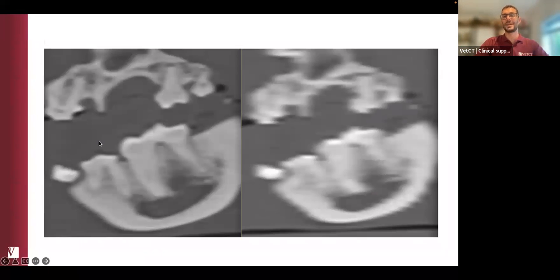So just make sure to quickly check that as well, particularly in orthopedics, where we are likely to need MPRs for interpretation. That's just another example of how two images that are identical in the transverse plane look completely different, because in this one there is more overlap. Okay, so here we can see the periodontal space. It is still not the best image, but quite a good image for teeth, and this is pretty much of no use.